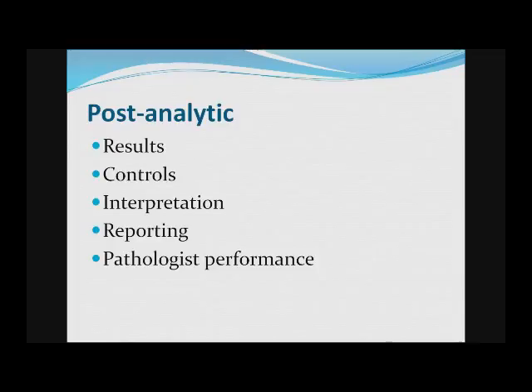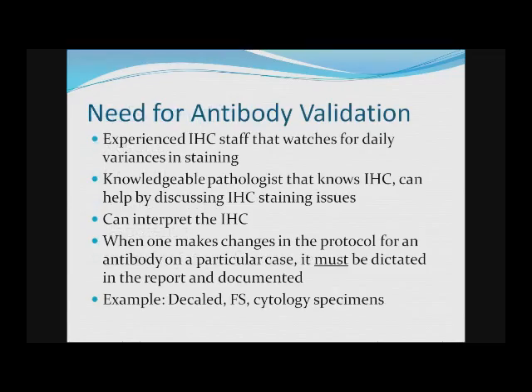The post-analytic is really a lot with the pathologist. They look at the controls, and they make the interpretation. They are responsible for reporting, but a lot of times the reporting does get verified by histotechs and other technical people. And this is sort of from our pathologist standpoint. They feel like the post-analytical is a pathologist's performance, you might say. We are on need for antibody validation.